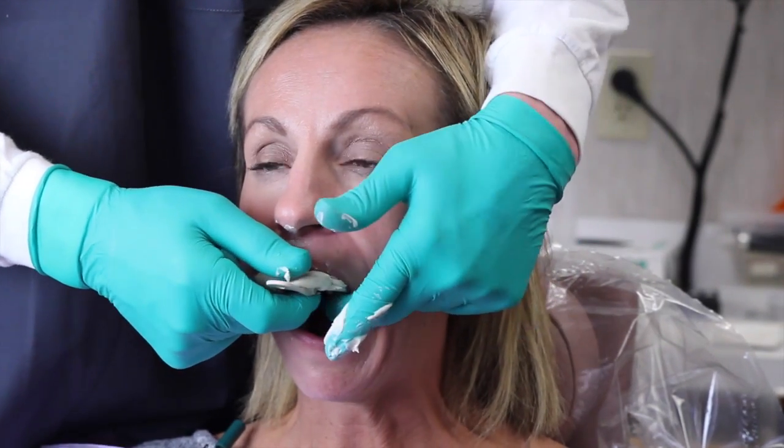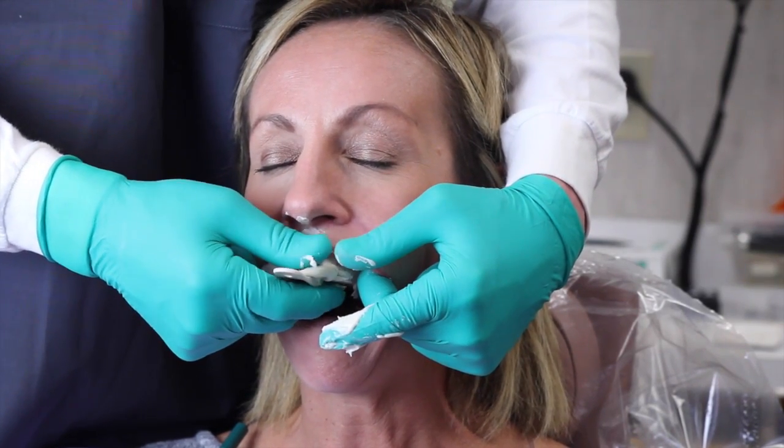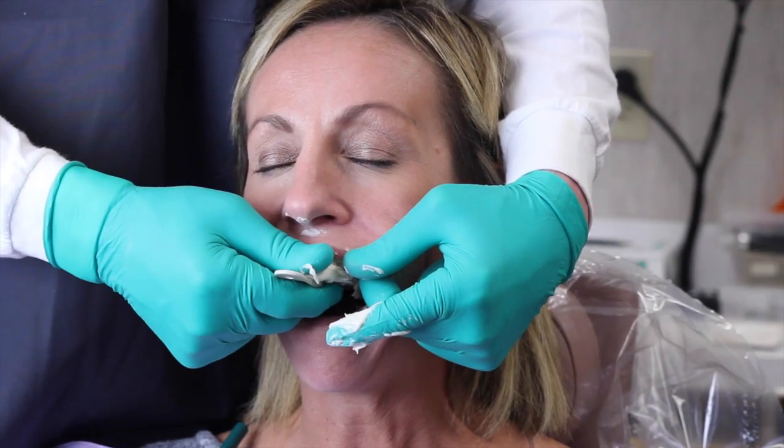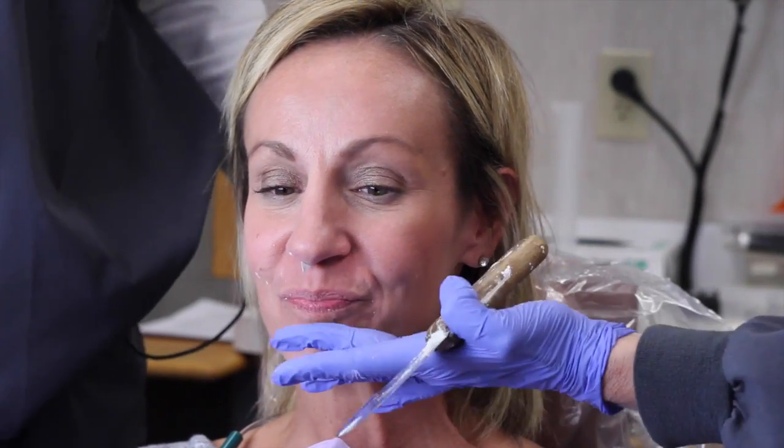Okay, now we're going to withdraw. Now again, typically these have a lot of suction, and sometimes they're hard or difficult to get out. And try to do it in a quick snap. Okay, good. And if we look here, I'll set this aside, and we'll give the patient a little napkin they already have. And as messy as that seems, that's probably neater than I usually am. I'm usually pretty messy. And with that, let's take a quick look at the impression itself.